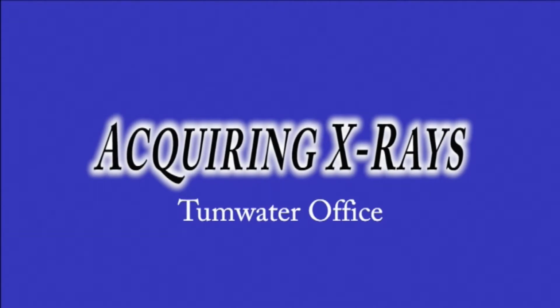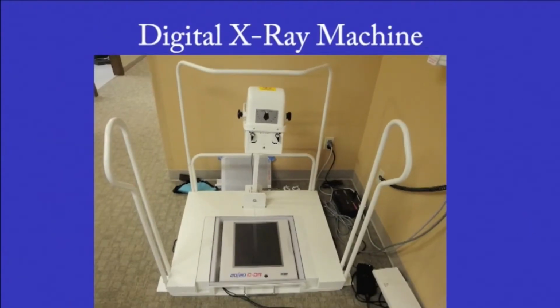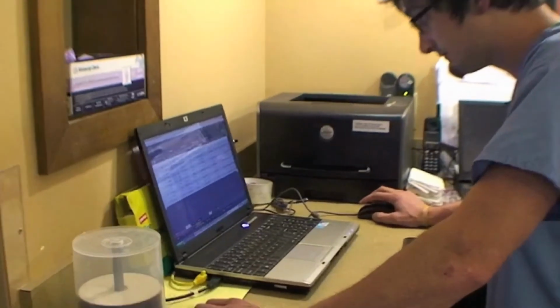Our Tumwater office uses a digital X-ray system. This makes the work of taking X-rays much easier and cuts the need for a developer, films, and multiple cassettes. The system is computerized and is run by a laptop found at the nurse's station next to the X-ray machine.